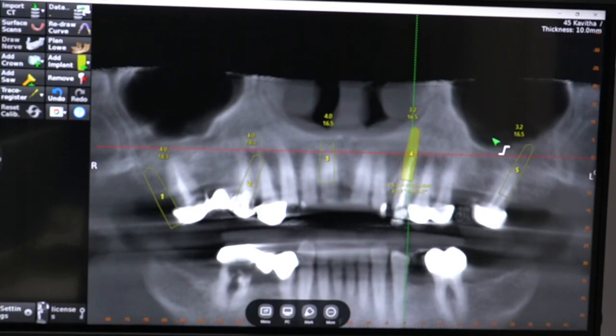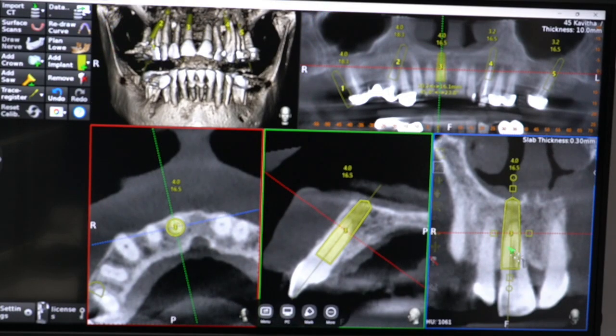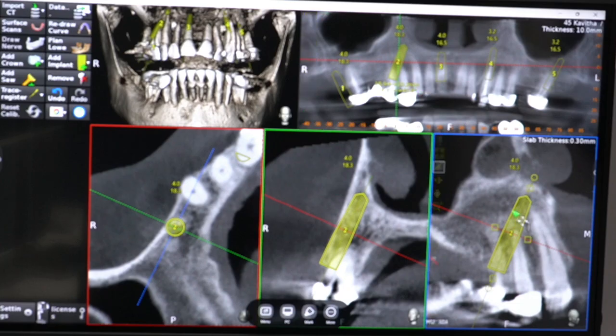So the challenge comes when the sinus moves in two directions, more anterior, more downward, and it complicates pterygoid implant placement when the sinus progresses distally towards the tuberosity. So we will plan for a first all on 4 style, then we will decide whether an additional molar implant is needed. So we will start the implant from the second premolar, which is a standard one. Sometimes we can start from the first molar also.